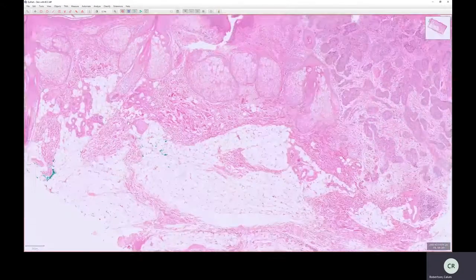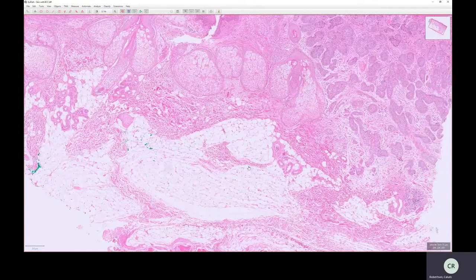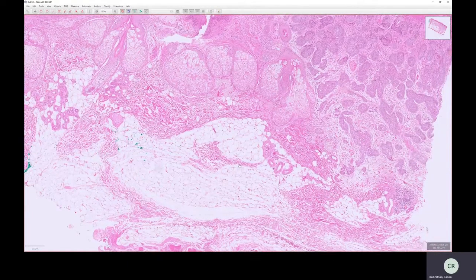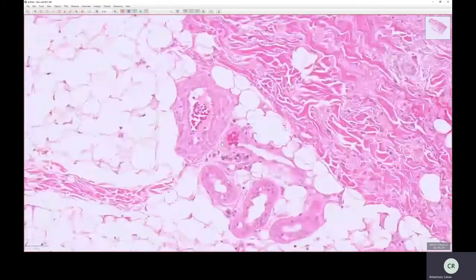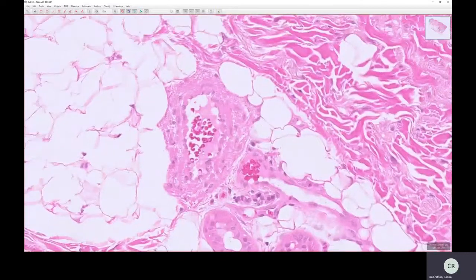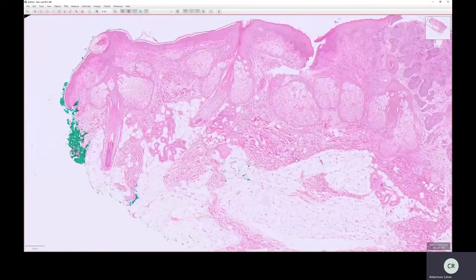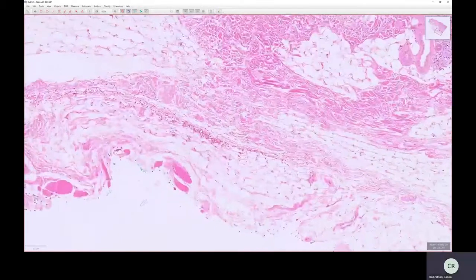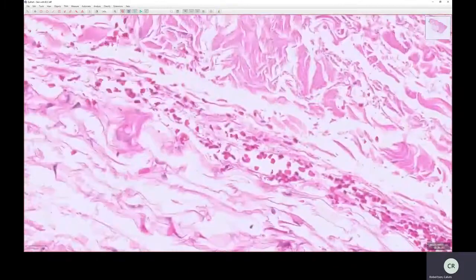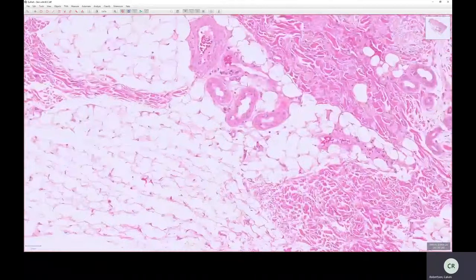So another main type of cell you get is blood constituent cells, amongst which there are inflammatory cells. Let's look at one type of blood constituent cells. Here's a blood vessel. Here's another blood vessel. And the main cell type is a bit blurry here. I wonder if we can find a less blurry example somewhere. It's been scanned. Don't seem to be able to find that. Perhaps we can see some here. Yeah, a wee bit blurry.